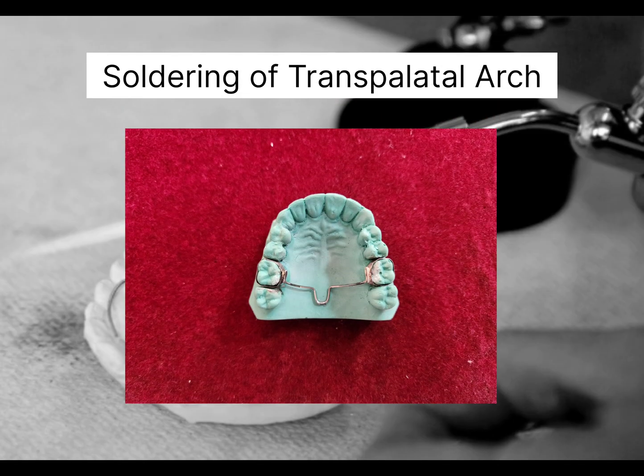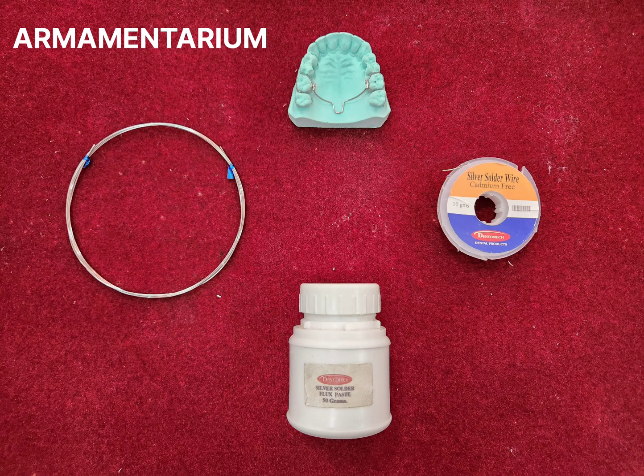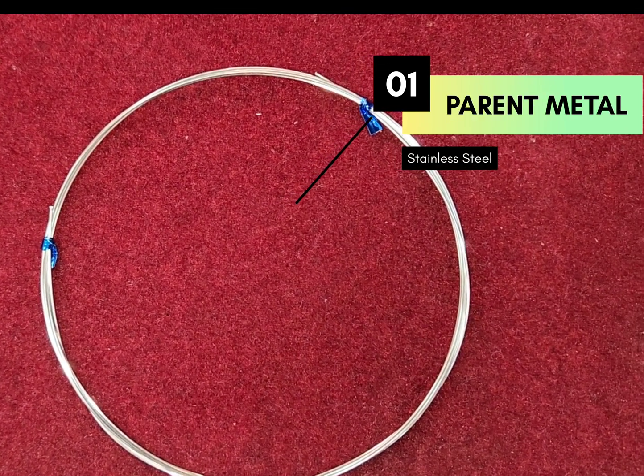For demonstration, we are securing a transpalatal arch. The armamentarium required are parent metal, silver solder, and flux. As parent metal or base metal, we are using stainless steel wire.